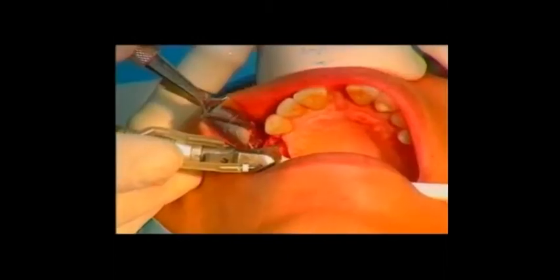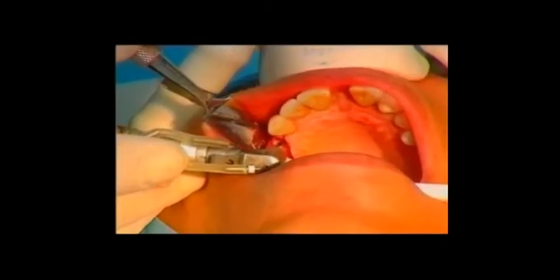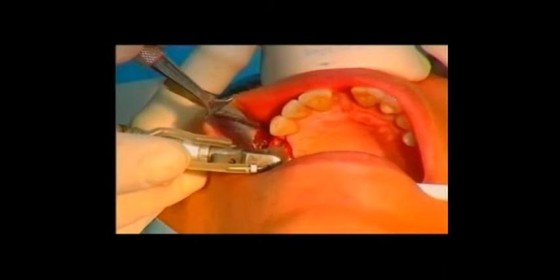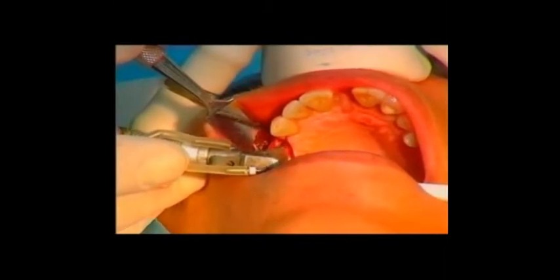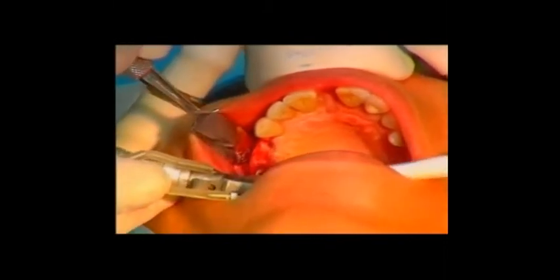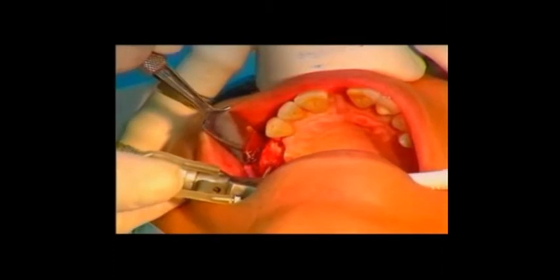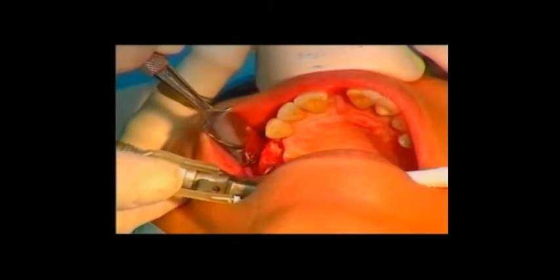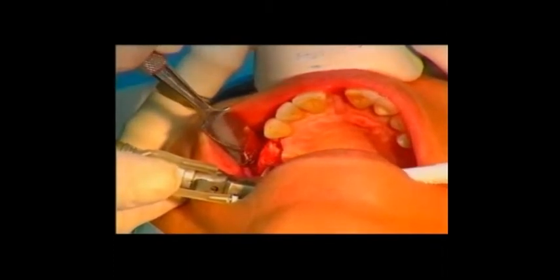The future implant insertion sites are marked with a pilot drill. The depth is predetermined according to measurements obtained from the CT scan, and the drilling should stop 1 millimeter below the sinus floor.